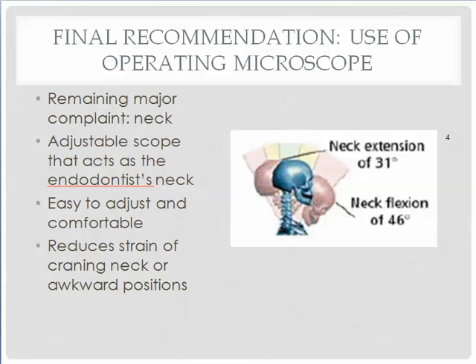Craning the neck or staying in an awkward position for extended periods of time are one of the major MSD complaints. Thus, allowing flexibility in deciding how close or far to place the operating microscope greatly mitigates these ergonomic concerns, assuming that one uses them properly.